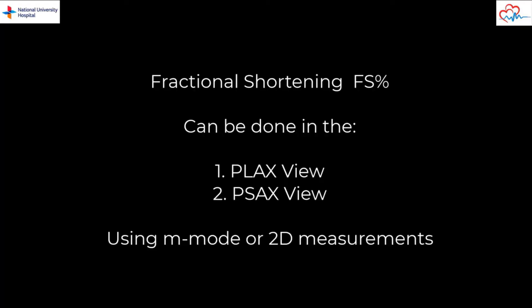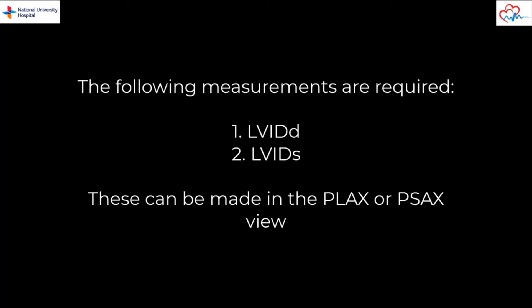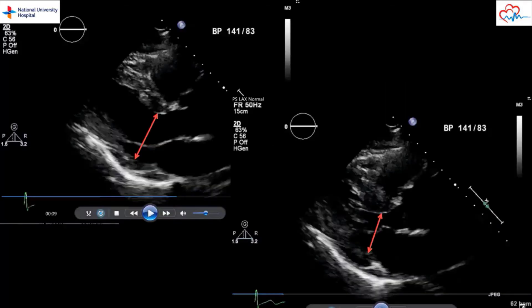The measurements required to determine fractional shortening can be obtained in the parasternal long axis or parasternal short axis view. Either M-mode or 2D measurements can be used. In order to determine fractional shortening, we need to first measure the internal diameter of the LV in both diastole and systole. These are the LV ID diastole and LV ID systole measurements. Both measurements are seen here being made in diastole and systole in 2D mode. The measurements are being made in the parasternal long axis view. The red arrows show where the measurements of the LV diameter should be made.